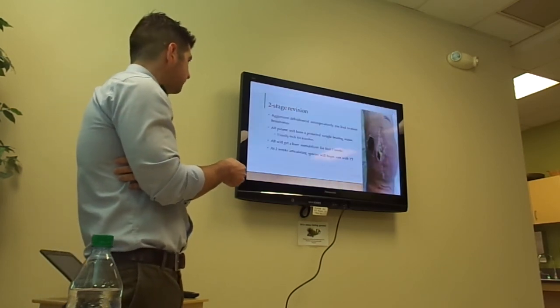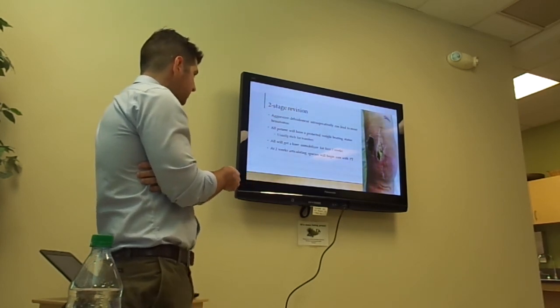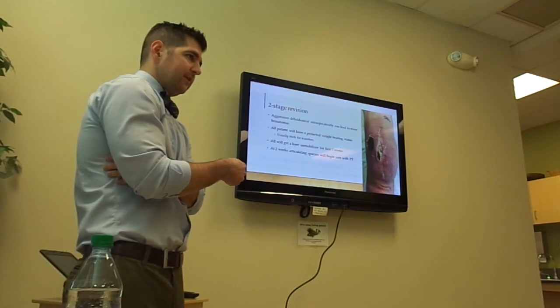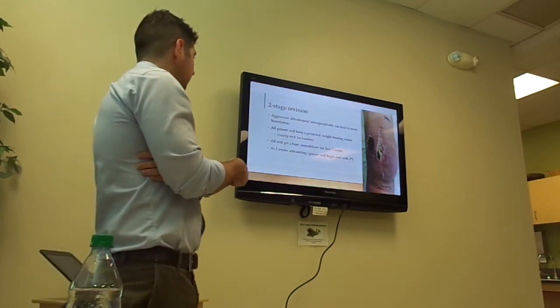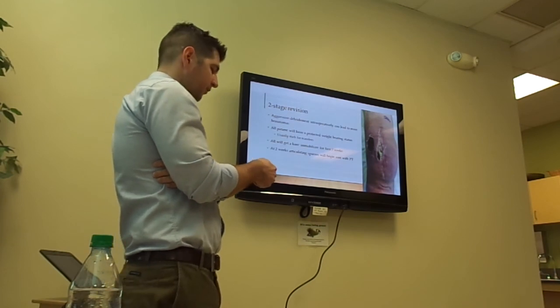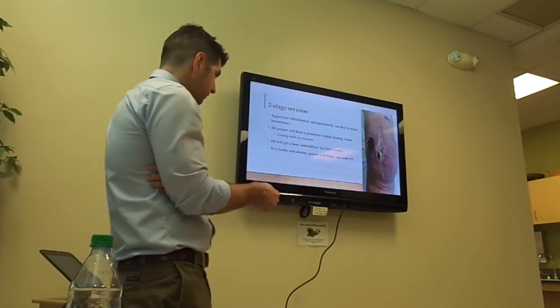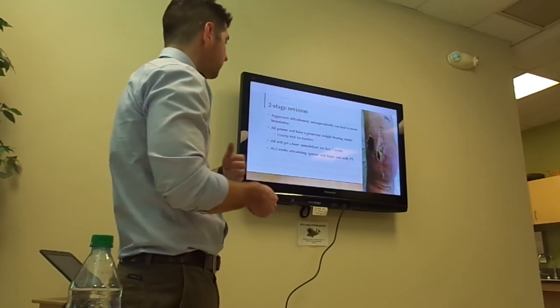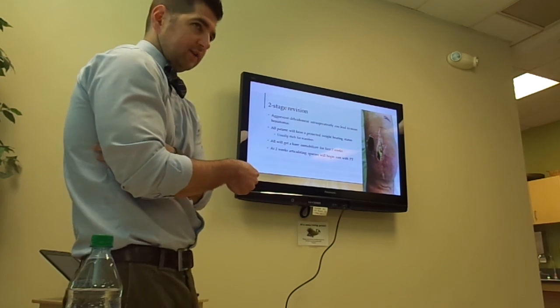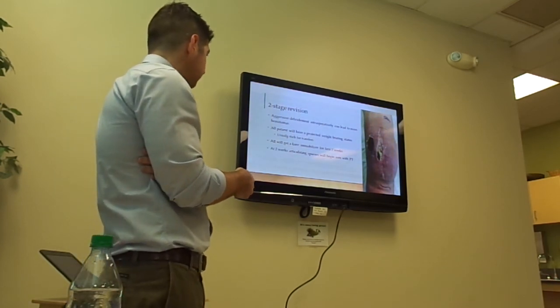Occasionally, I have had one patient get some renal failure from all the vancomycin, but for the most part, those are pretty safe doses. You can see here, this guy had really bad soft tissues. He got himself a static spacer. So that's kind of what we're looking to see. Do they have this horrible wound, or does it look kind of like a normal total knee, but they just have an underlying infection?